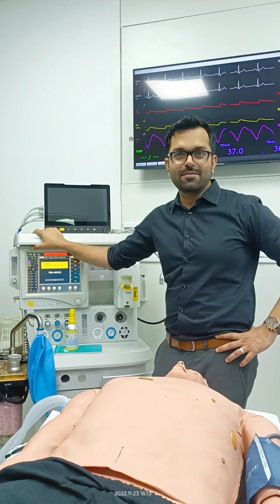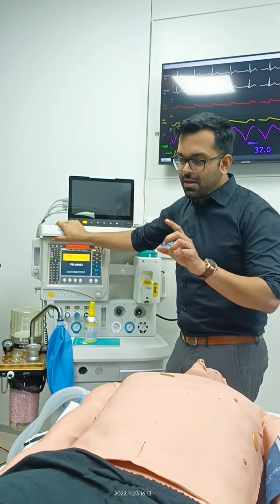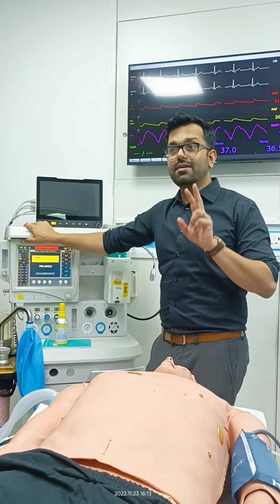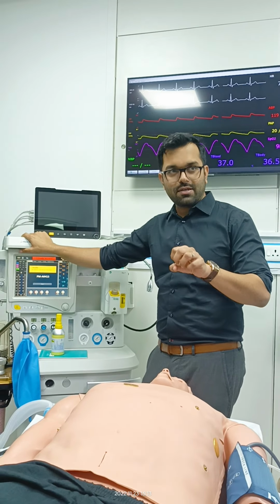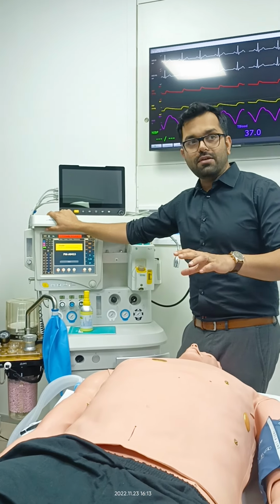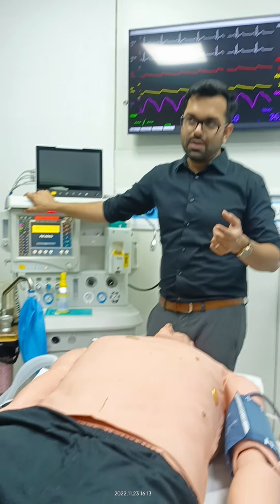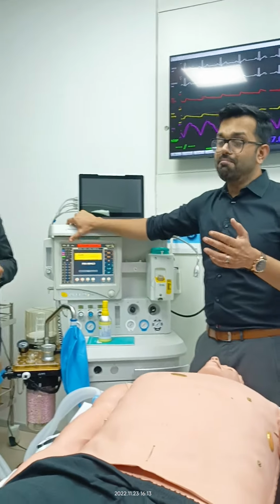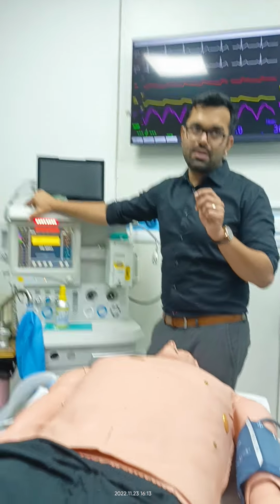So we never give 100% oxygen. One thing, it's not required. Second thing, it's harmful. It can cause atelectasis of the lungs. Secondly, if it's a pediatric case, because of free radical production, it can cause further changes in the lung parameters. We don't know that. So we mix it with compressed air.